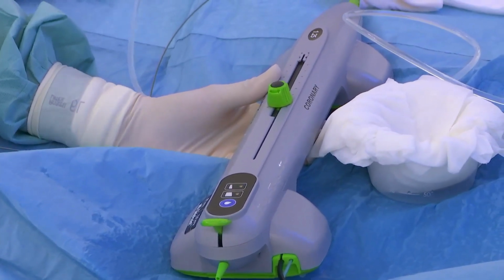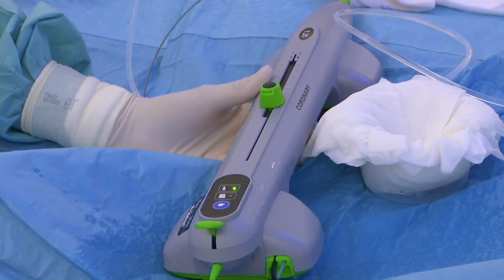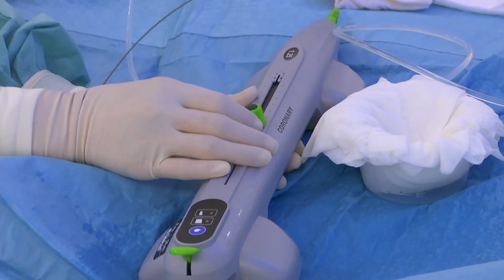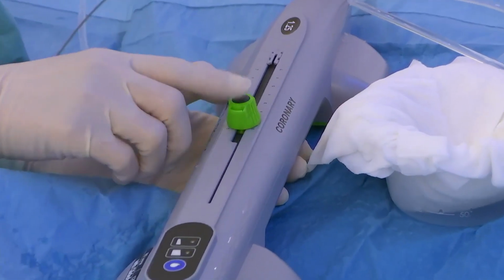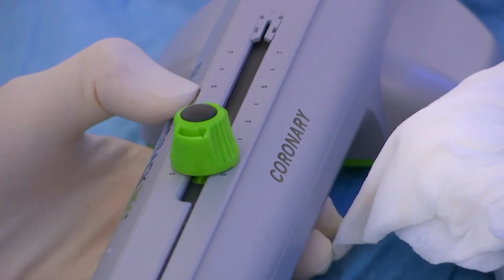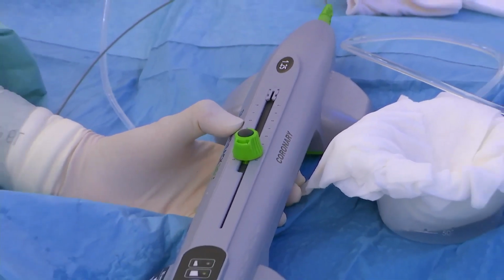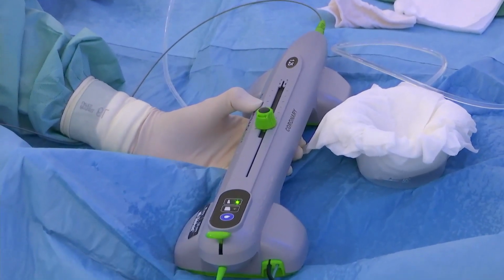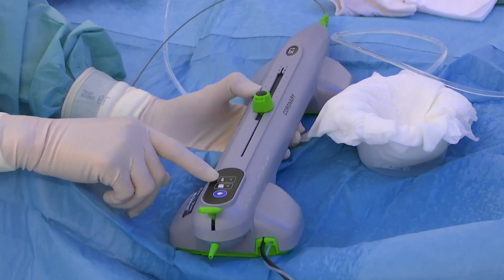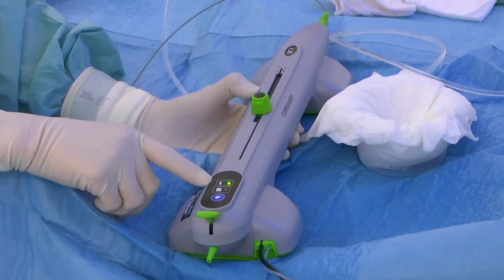But sometimes if you have a big vessel, you can also use the high speed, so your orbit may become a little bit bigger. This is the on-off button, and when you enter your guiding or the coronaries, you can use glide assist to reduce the friction. So if you enter the system, you can use glide assist. If you push this button for 3 seconds, then it will blink.